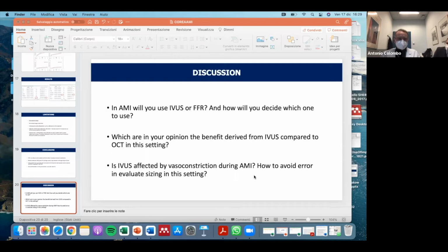So there is a strong rationale in one direction, but there is also a strong rationale in the other direction. Okay. And there are some reasons why people are so reluctant to do IVUS in acute MI. I mean, it's almost a universal feeling. I'm not convinced. If I have an MI, I prefer not to get IVUS on me.